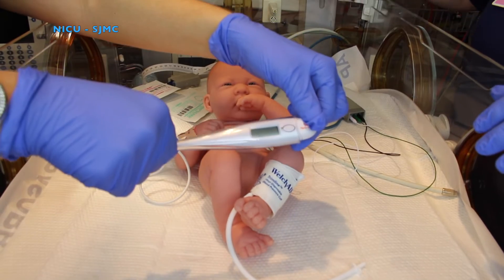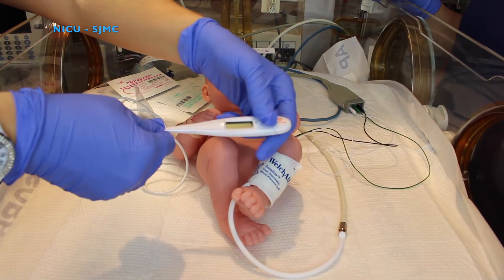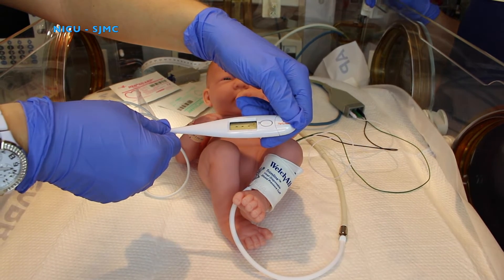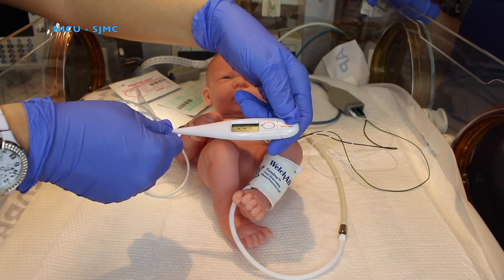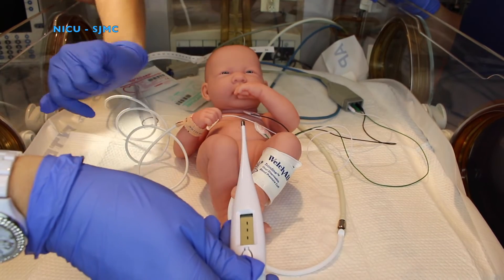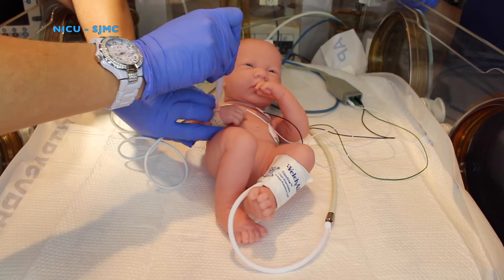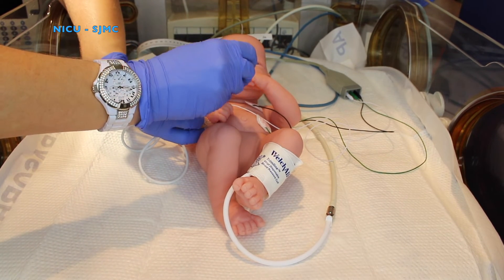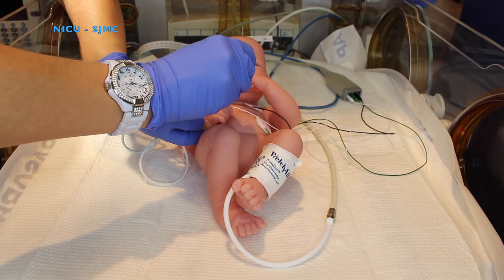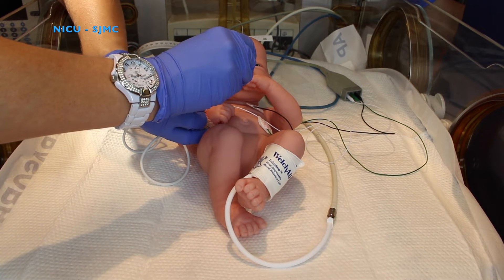Then take a temperature. Turn the thermometer on by pressing the button. How you'll know it's ready — you see the dashes. Place the metal tip directly touching skin only, all the way around axillary under the armpit. The F will flash until it is finished. You either hear the beep indicator or the F stops flashing — that is your temperature.